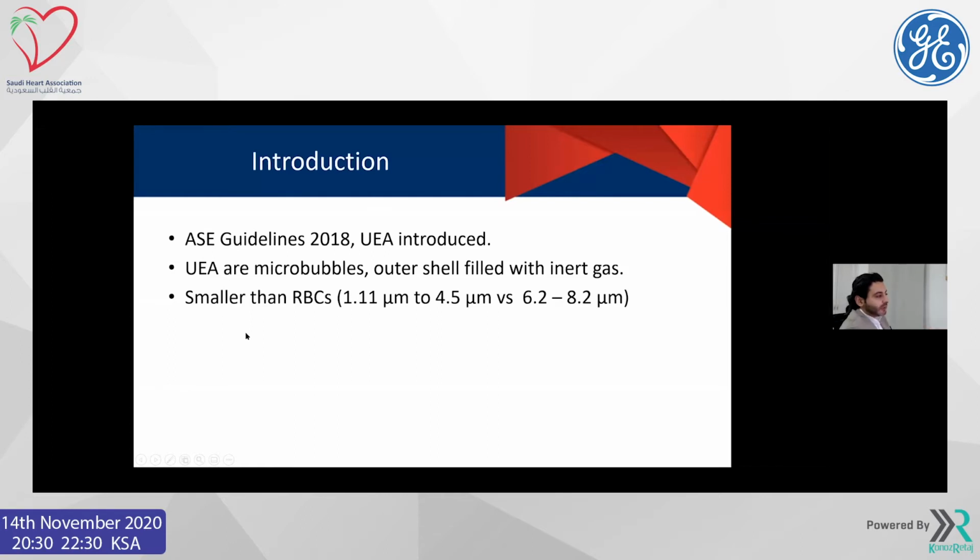It's a microbubble. It has an outer shell that is filled with inert gas. Depending on the brand, you will have different gas and different outer shell material. It has to be smaller than the RBC because it has to bypass the lungs and go to the left side.